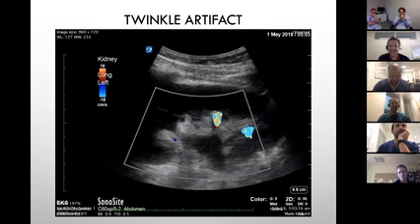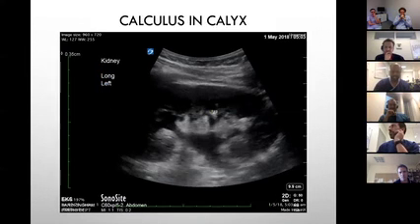The exact mechanism is not known yet. There are theories for why it happens. Anyway, we don't have to go into that one. But that gives you another idea. I've got an echogenic structure there. I'm not really sure whether it's a vessel hit more perpendicularly causing that kind of shadow, or gas in the kidneys, or actually a stone. So you throw in a color, it would probably give you this.